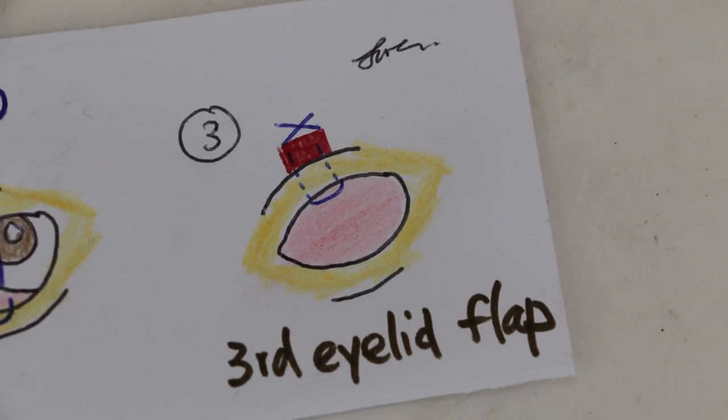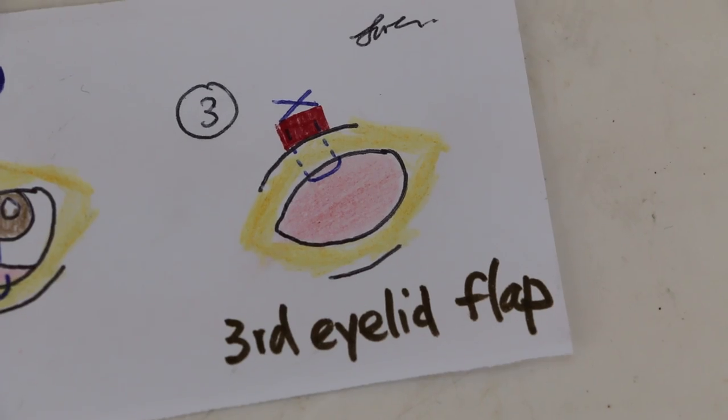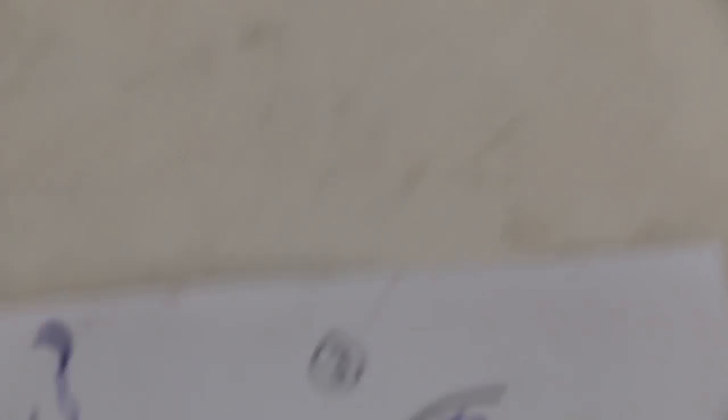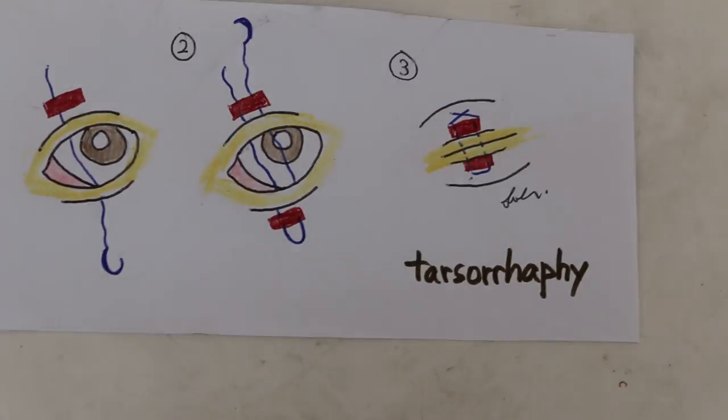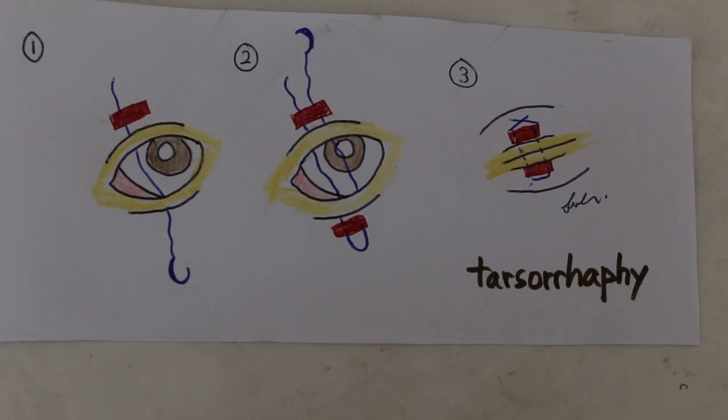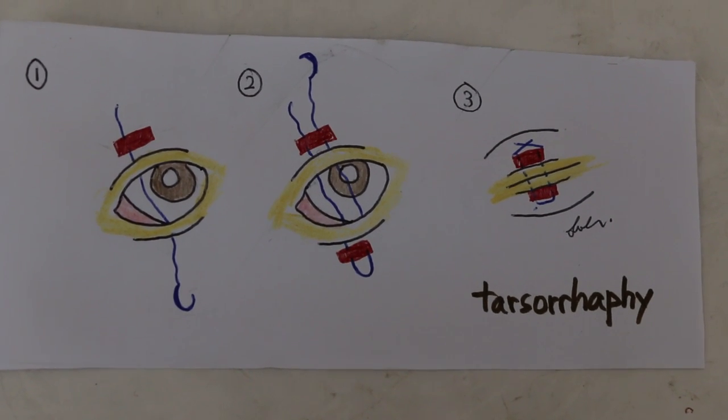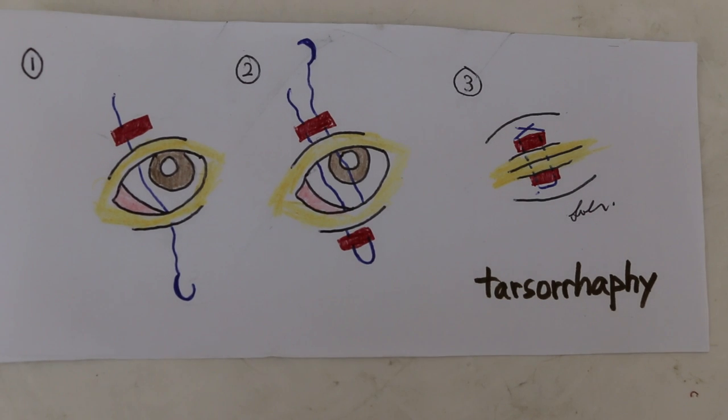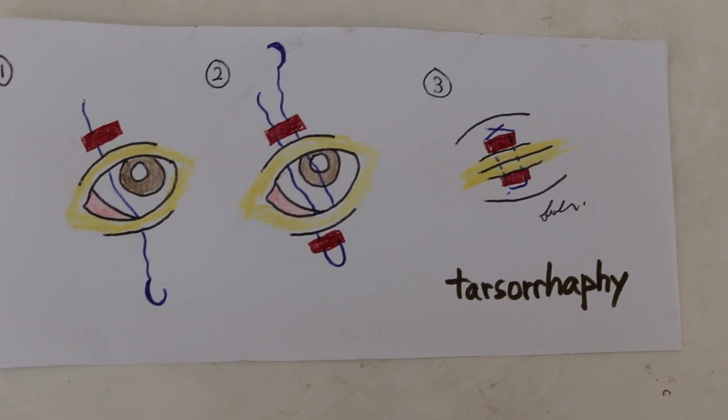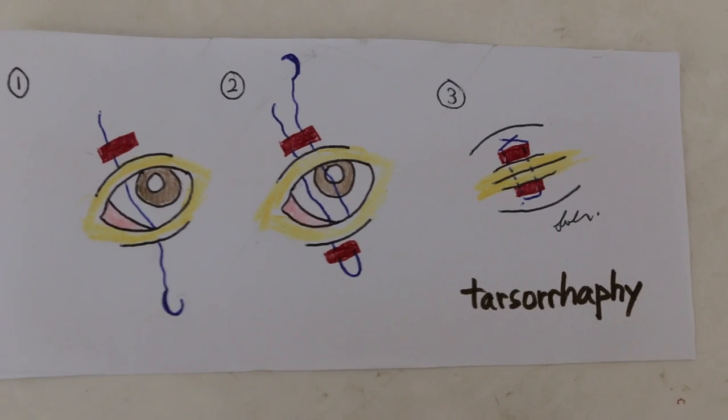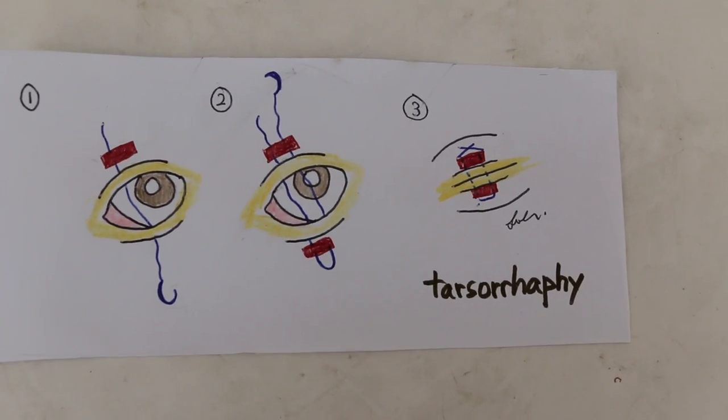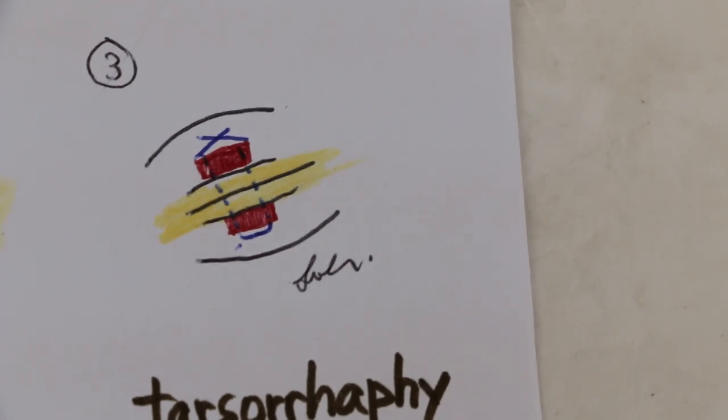This is like a horizontal mattress involving third eyelid. Now the other method is just the upper and lower eyelids, where you just go through the upper eyelid, and then down to the lower eyelid, and come back again like a horizontal mattress, not involving the third eyelid flap. No third eyelid flap.